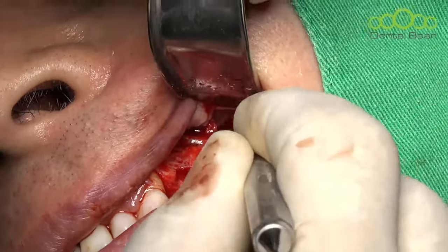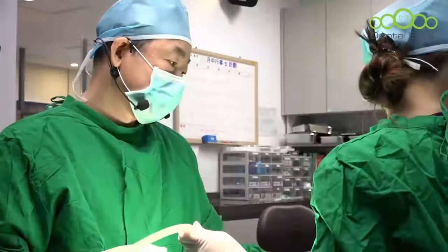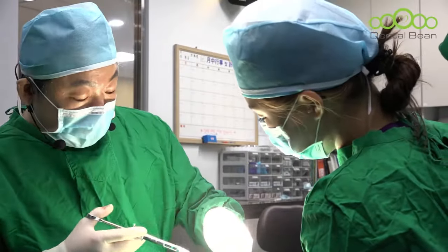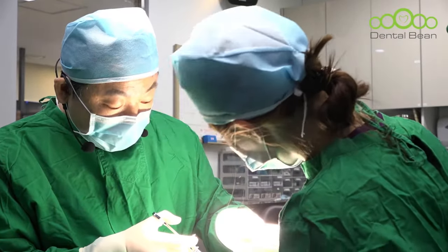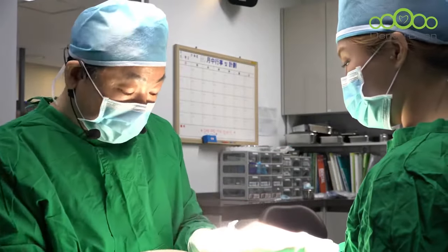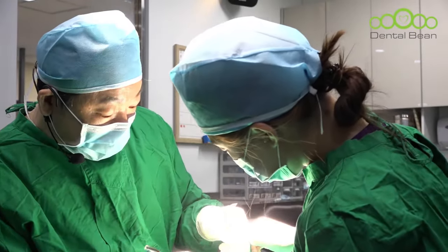Okay, the distal side is already separated because the patient feels discomfort. Watch it. I'll inject some solution at that side. It's a very rare situation. The patient feels discomfort during the membrane separation. Touch lightly. Close. The field is not good.